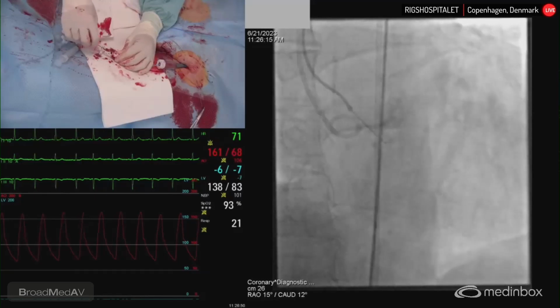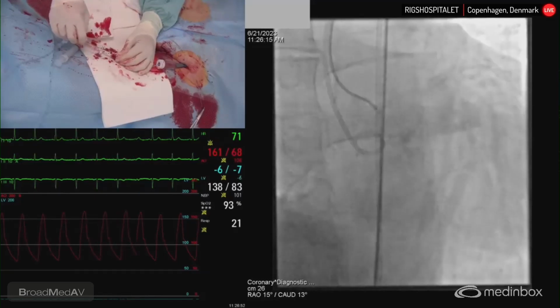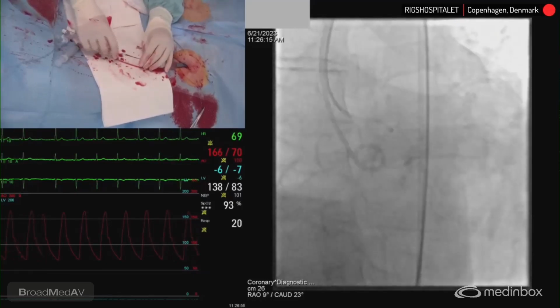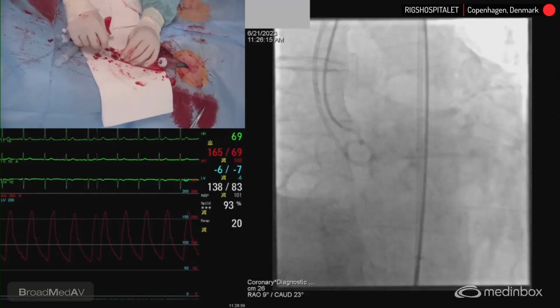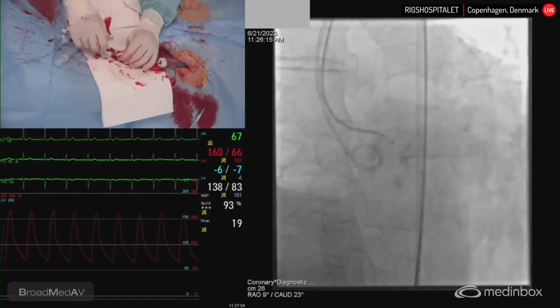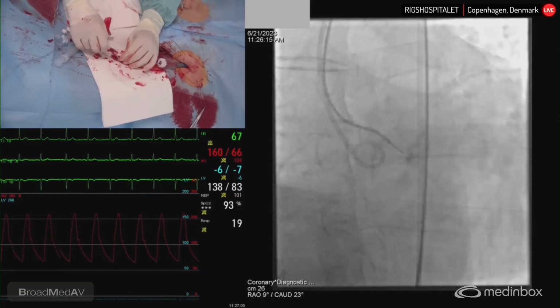We're in a good angle. What? Yeah, we are. Well, not perfect. There's some horizontality in it. I think we miss some height, but then sometimes the L2 doesn't make it necessarily better, you know? Yeah, it's more indeed higher up.